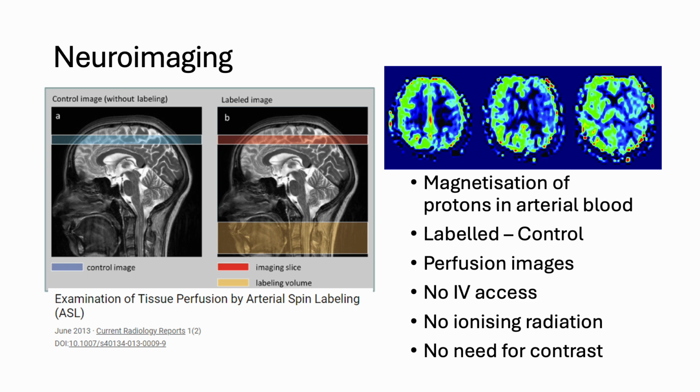And it's great because it doesn't require any IV access, there's no need for contrast or ionizing radiation, and you can perform perfusion images without having to cannulate the patient.